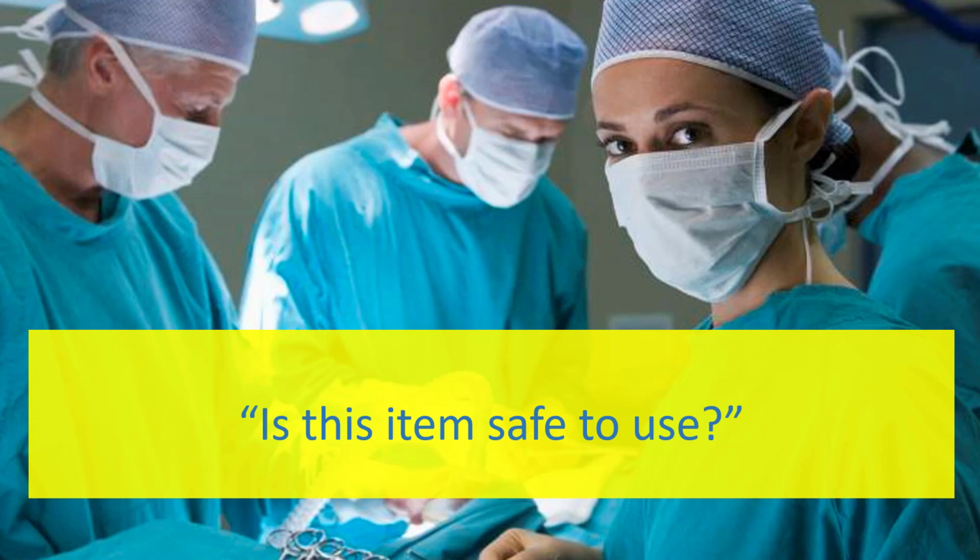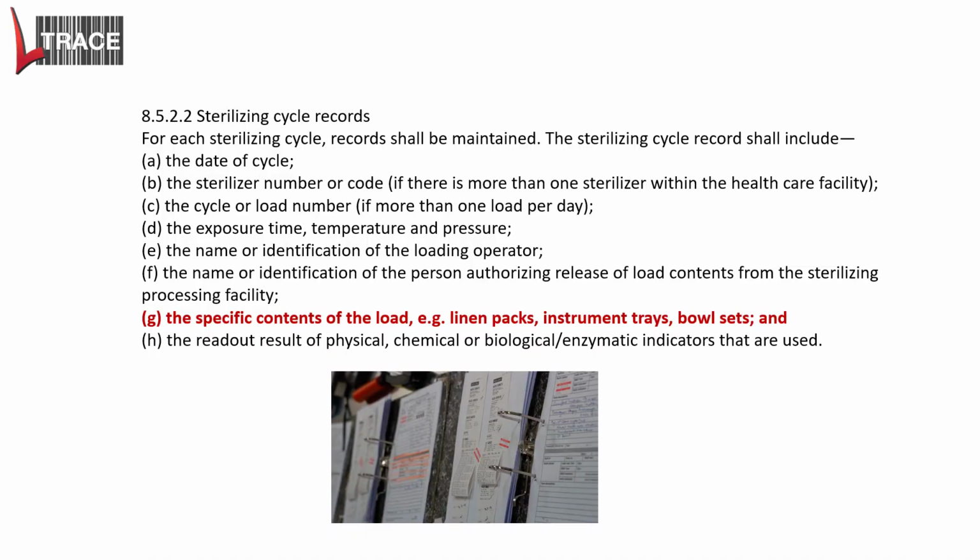So at the point of a procedure, a nurse needs to be able to look at any wrapped item and know that it's been sterilised and is safe. It needs to be recorded with each sterilisation load. And so we're familiar with most of it, but the interesting one is G, the specific contents of the load. For example, linen packs, instrument trays, bowls, sets, or whatever.